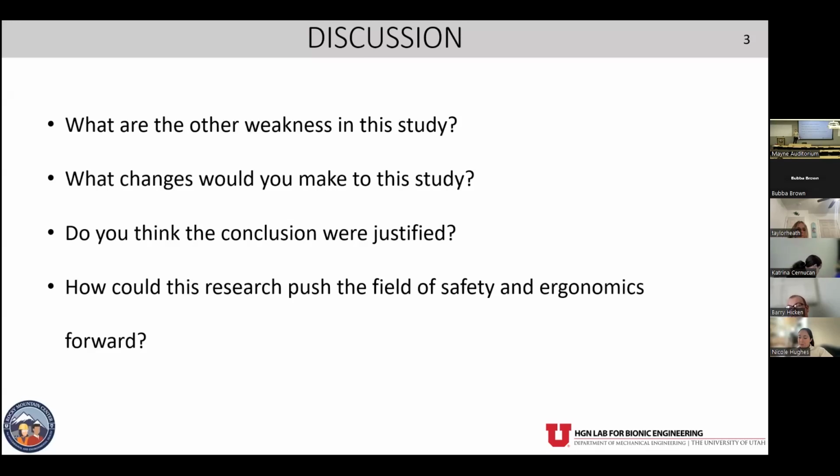Again, if you're going to be measuring muscle activation, this is the easiest way to do it, but they're not super easy to use, in that where I need to put it on Kai's arm is going to be pretty different from where I need to put it on my arm. So you need someone who really understands that and understands what those signals should look like. Each one of those EMG sensors is going to need the correct signaling going before you can look at it all. Did that answer your question?